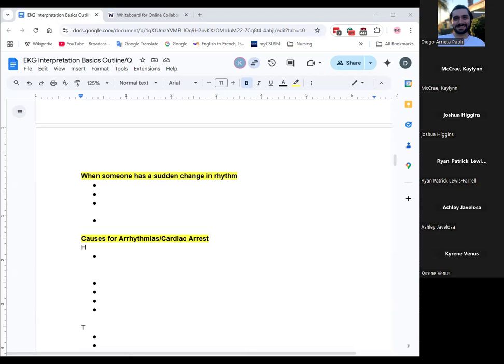Checking on the patient in the room. I hope y'all would do it, because we might see stuff on the monitor that isn't inherently true either. So when I say it's not inherently true, what could I be seeing on the monitor that's not true? Artifacts, yeah. So you might see artifacts, from them moving around a lot, malpositioning.